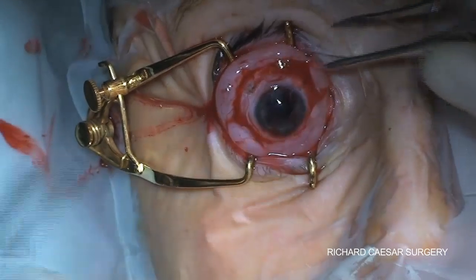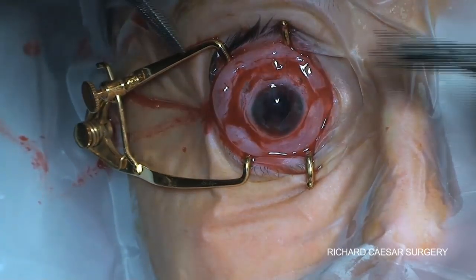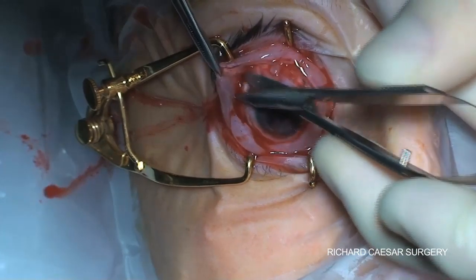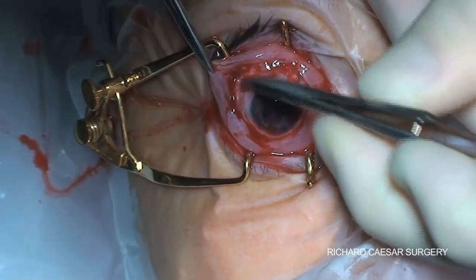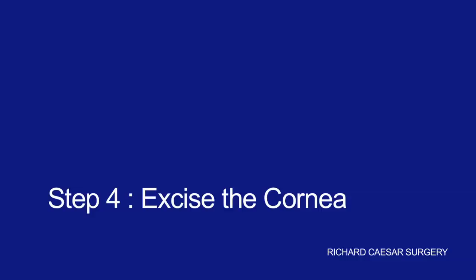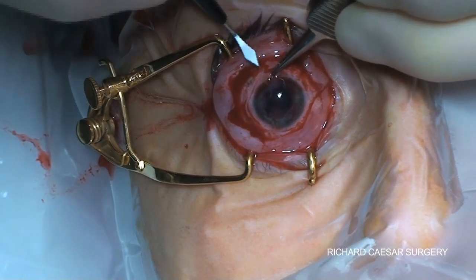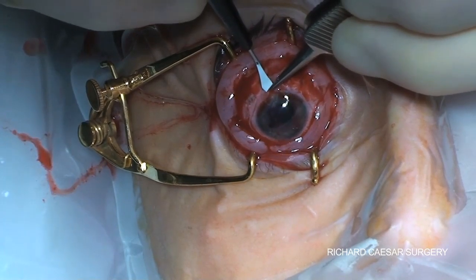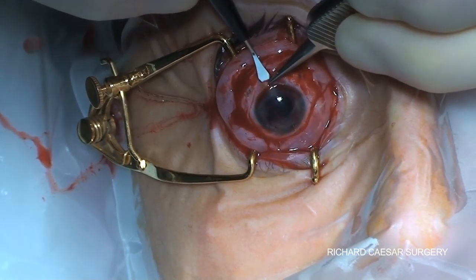At the end of this stage you want to have the feeling that both your conjunctiva and subtenons layers are going to be quite mobile as you close the sclera. The next step is to excise the cornea and you need to make sure that you come right to the edge of any residual adherent conjunctiva — this can't be left behind.